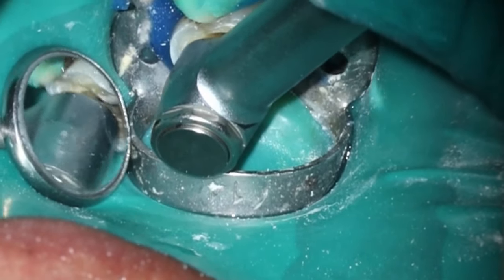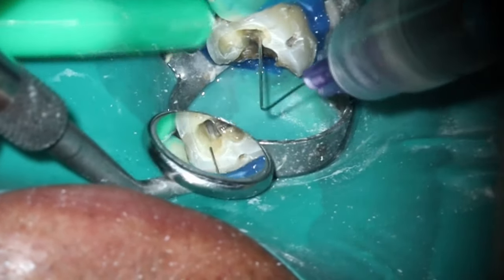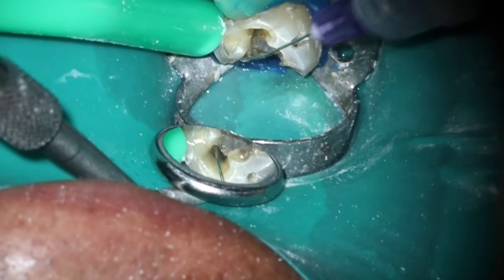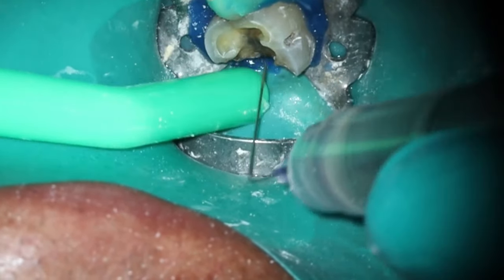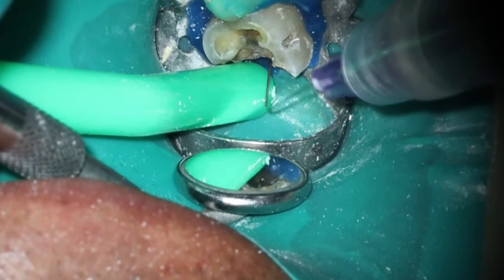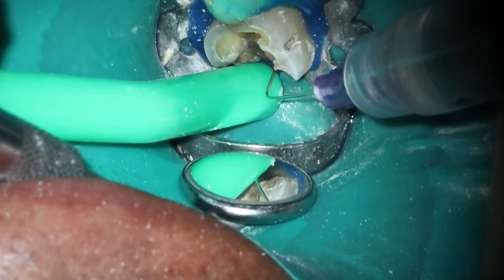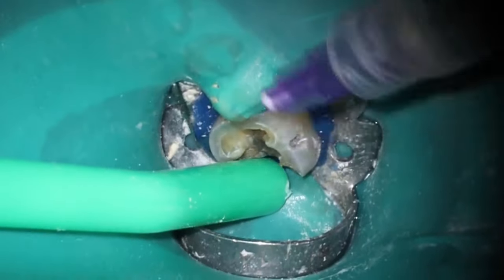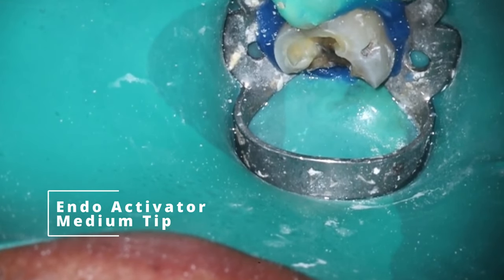Getting the other distal. At this point going to do the mesials, just like you've seen me do in the past — nothing too extravagant. This was a type 2 system. Very pleased with the final x-ray on this one, which I'll show you in a few minutes. Going to do the final rinse process here with Triton to get it all cleaned out. Not concerned about the tissue underneath the truss. EIE does make some curved ultrasonics that you can use to clean out underneath there, but the whole point of doing an access this way is to conserve as much tooth structure as possible.